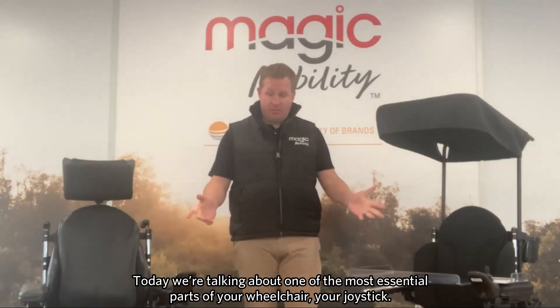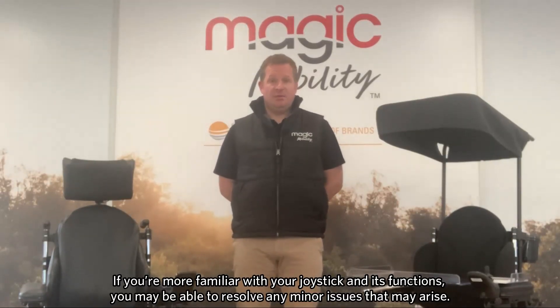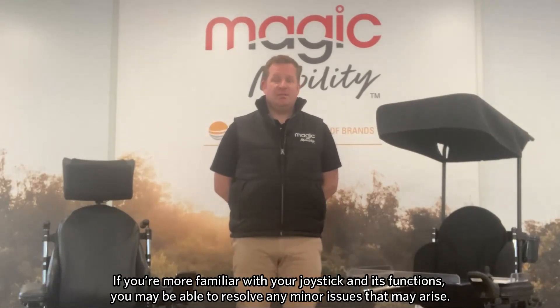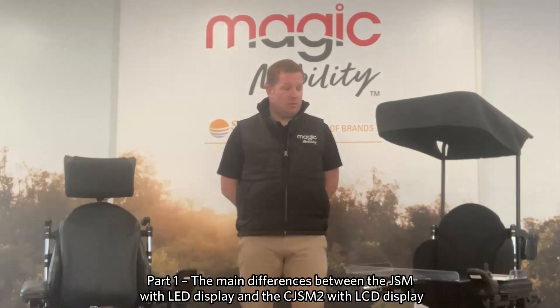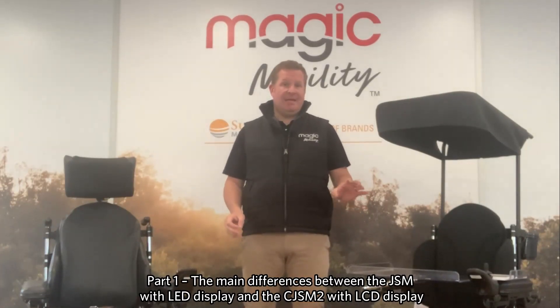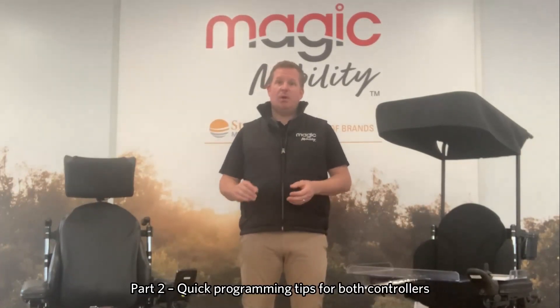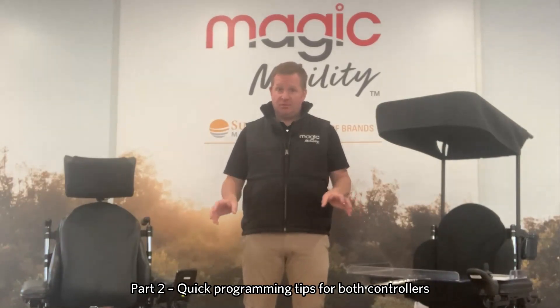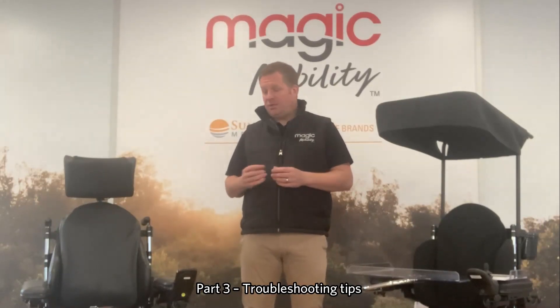Hi, I'm Scott Staunton, one of the rehab engineers here at Magic Mobility, and today we're going to step you through one of the most essential parts of your wheelchair, which is your joystick. Sometimes things can go wrong, so if you're more familiar with the joystick and the functions of it, hopefully you can address any issues that might arise. Today the video will be in three parts: we'll talk about the main differences between the two types of joysticks we have on our chairs — the JSM with LED display and the CJSM2 with the LCD display — then some quick programming tips, and then some troubleshooting tips on any issues that might come up with the chair and why it might not be working.